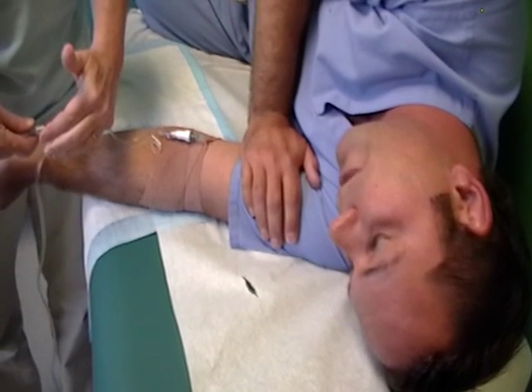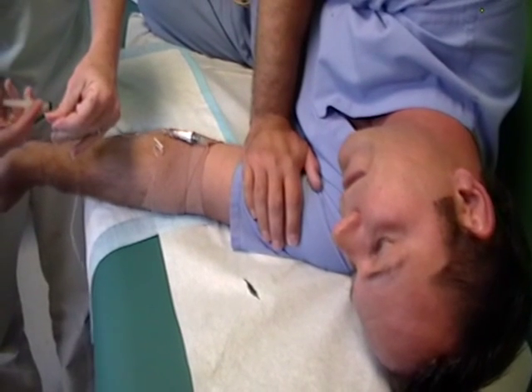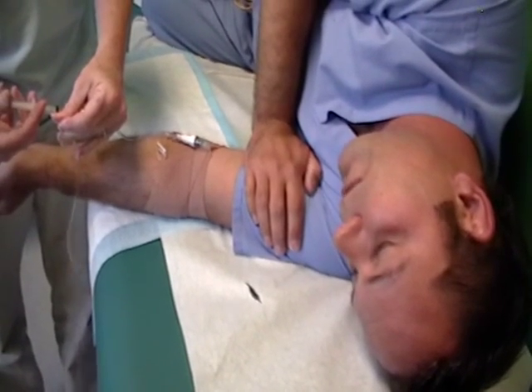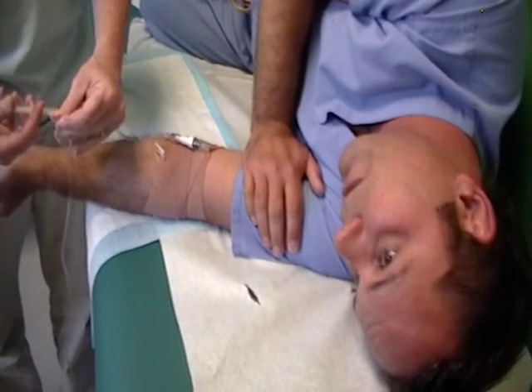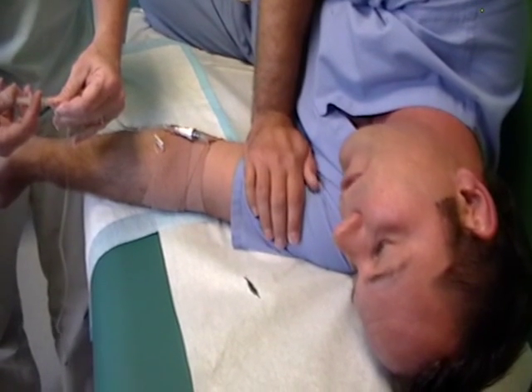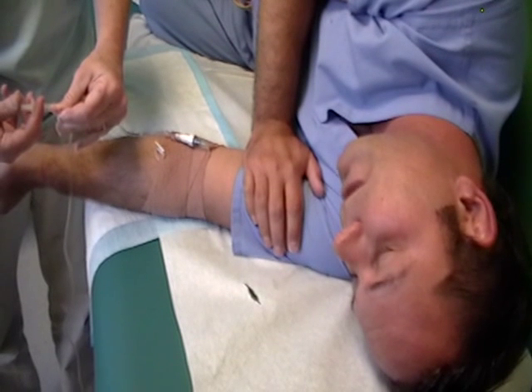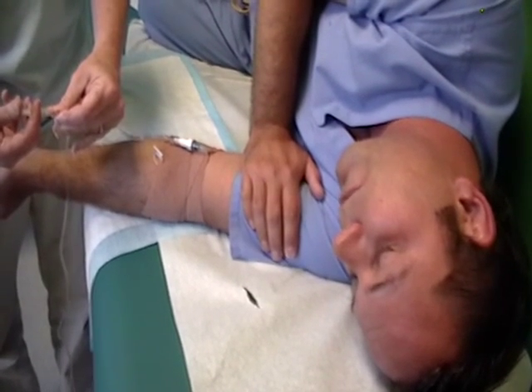She'll let a little bit of fluid in, then clamp off the upstream flow again and push. It's important to go very slowly with medications. Some medicines you need to go slower than others, but in general go slow with medications because they can all drop blood pressure, cause all sorts of vital sign changes, cause extravasation into the tissue, etc.